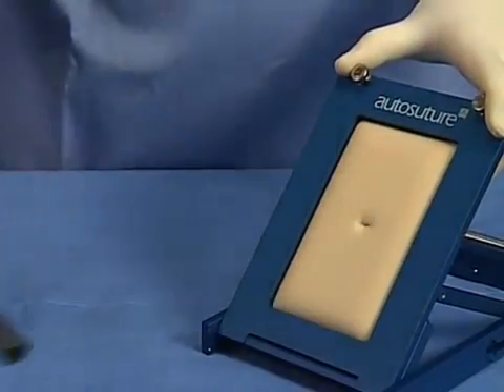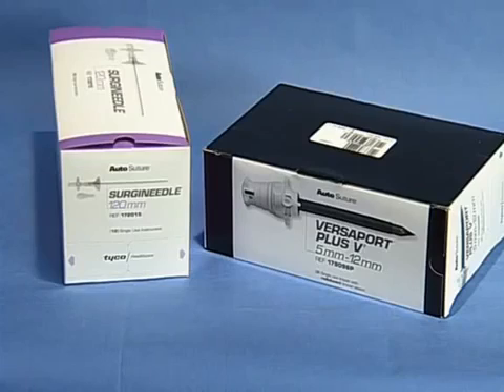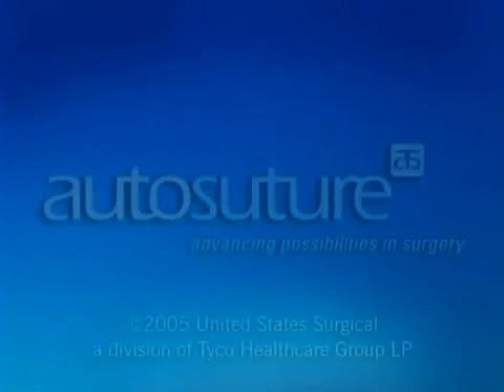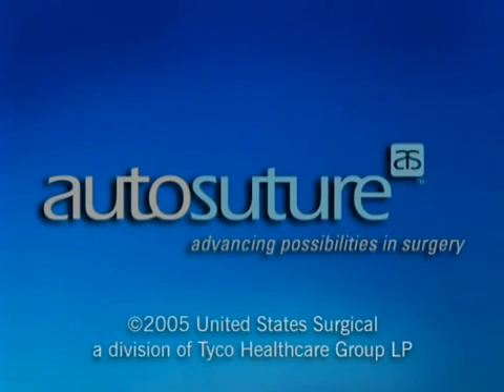Remove the obturator. The Versaport Plus V2 Trocar comes in a wide range of cannula sizes and cannula lengths in both disposable and reposable configurations. For more information about the AutoSuture Versaport Plus V2 Trocar, please refer to the instructions for use or the AutoSuture product catalog at www.autosuture.com.